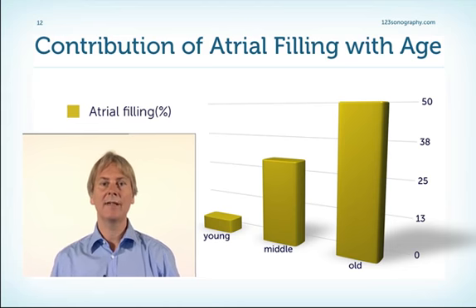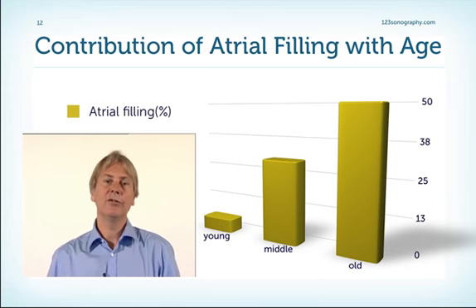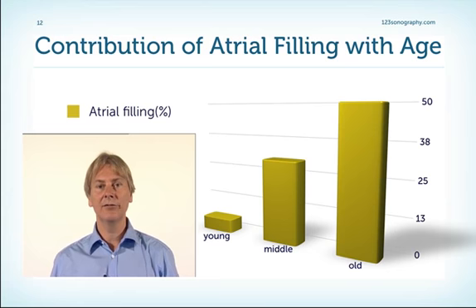Especially if you relate it to the size of the E wave. And if we get older and the ventricles get stiffer, we have more component of atrial contraction, which is relevant for filling. This is also the reason why it's so important to maintain sinus rhythm in patients who get older and in patients who have stiff ventricles.